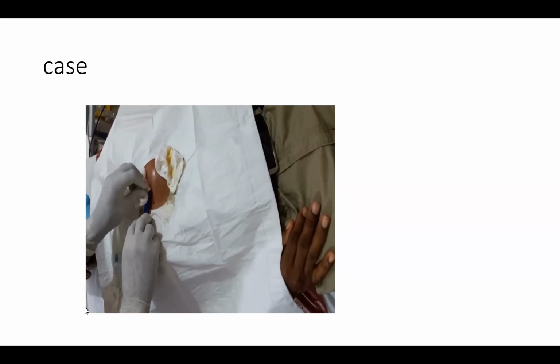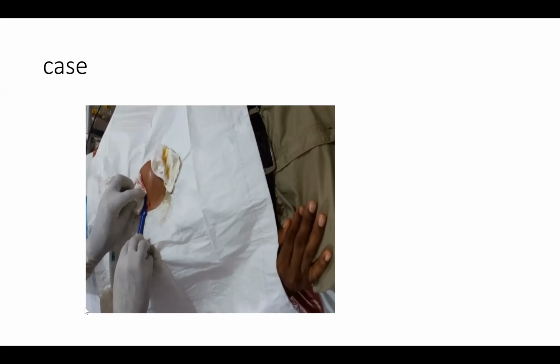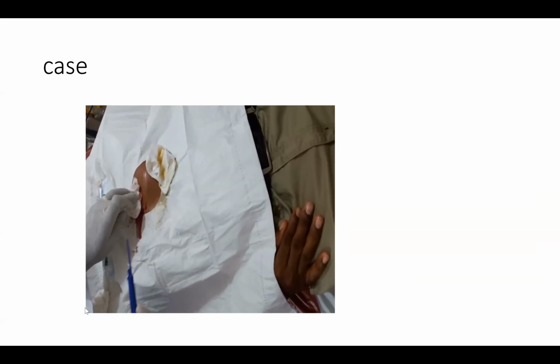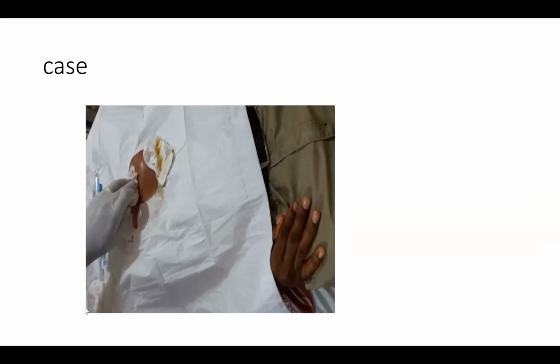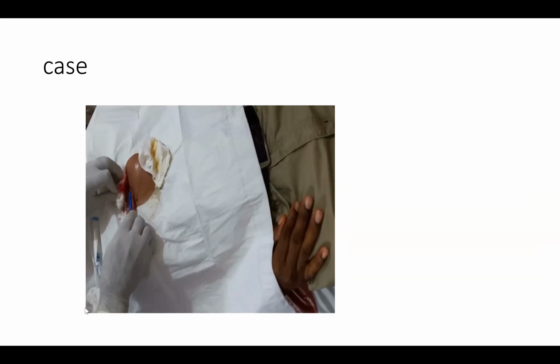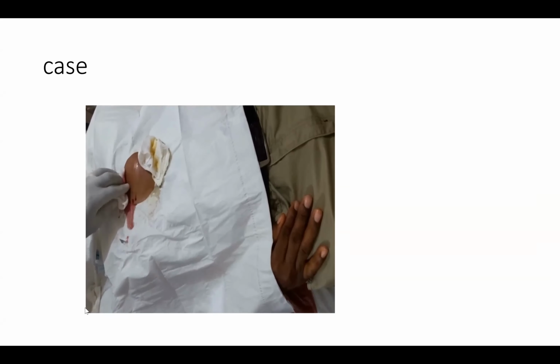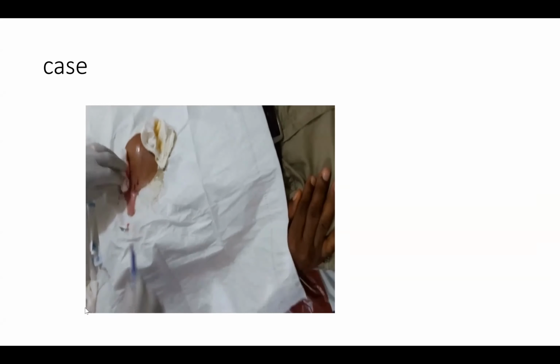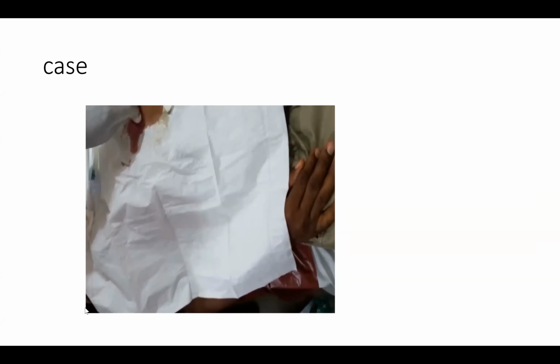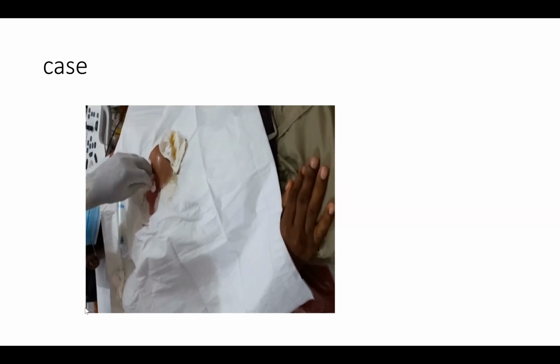Then also, as Dr. Chris said, I use an absorbable suture just to close the point of the punch. And if you adequately anesthetize along the path of that skin, because I give the anesthetic under the subcute, it raises the skin for you. So you take it across the length of the direction we go. When you are at the fourth intercostal space, you point it at an angle of 45 degrees.